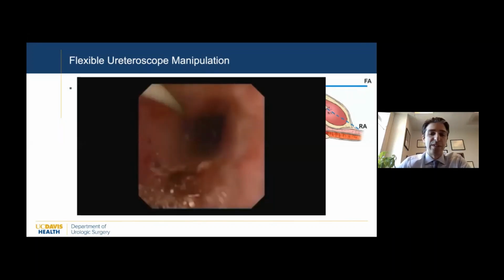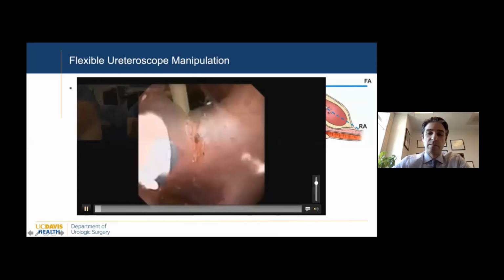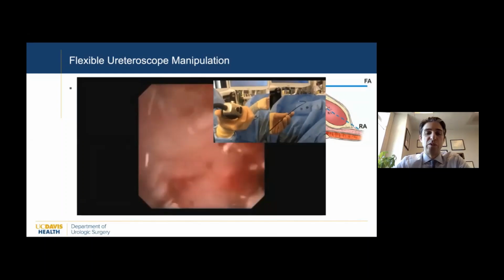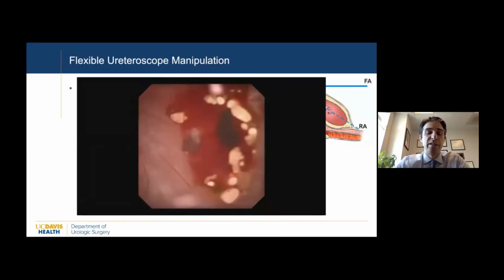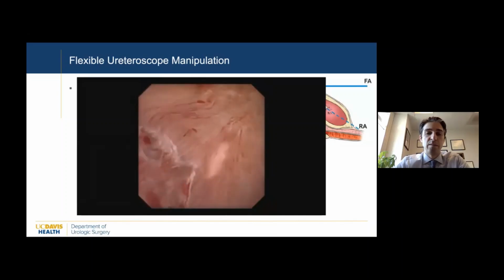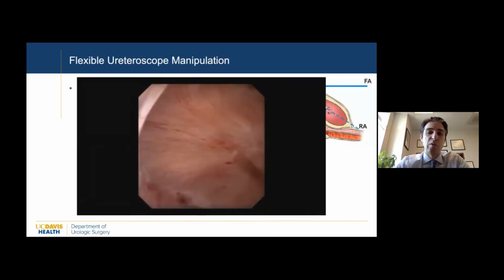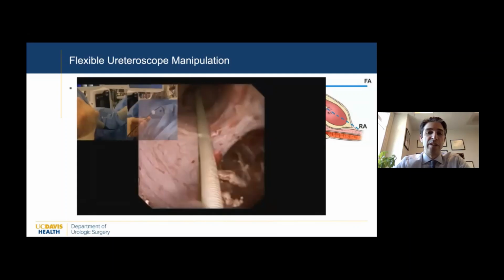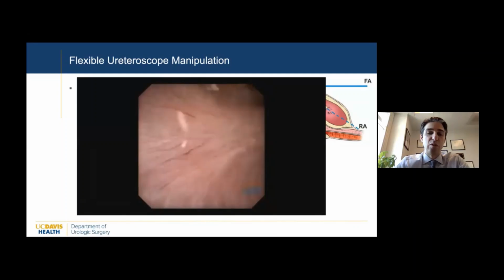So this is just a brief demonstration of flexible nephroscopy at the end of a case. This is actually the upper pole here, so it's medial to our UPJ location. So we do rotate. It's a left kidney, so I'm rotating to the right there. But all the other calyces, as we go through them, again, this is a left kidney, my rotation is going to be to the left. So again, we rotate left to look right.